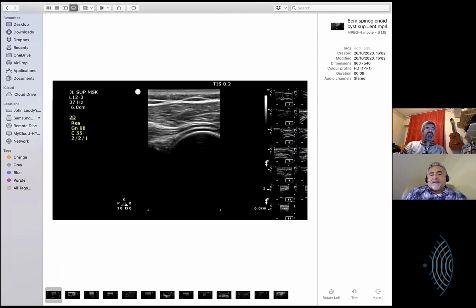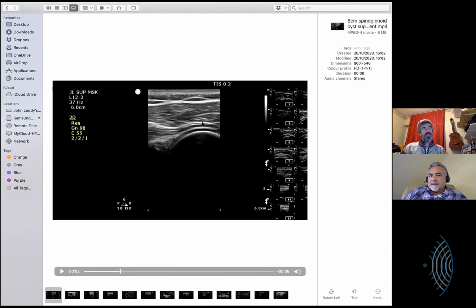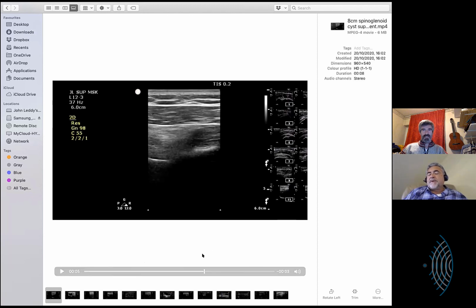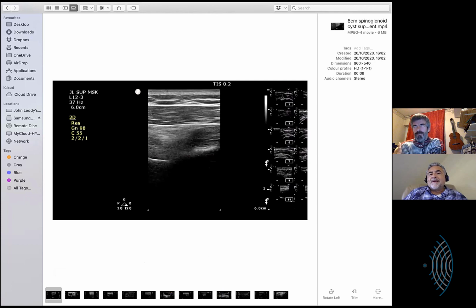Above that, the very top of that is deltoid. Yes, probably. I always get confused as to whether we're looking at the traps or supraspinatus. It's deltoid below supraspinatus. Because of the spine of the scapula, it becomes lats or traps or something like that. I think of it as deltoid all the way around, really. The deltoid hangs off front, back, and side. So usually you're looking through deltoid.